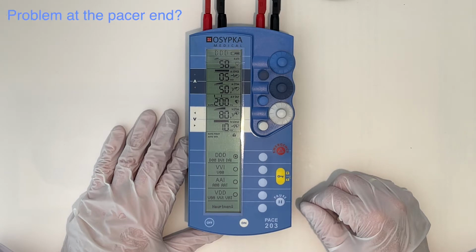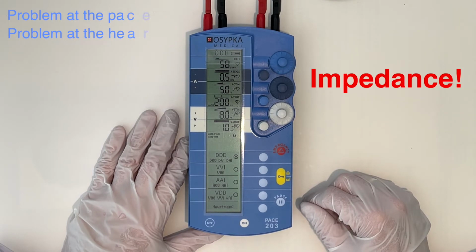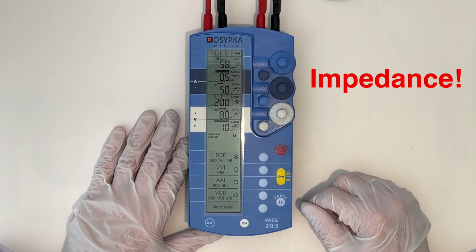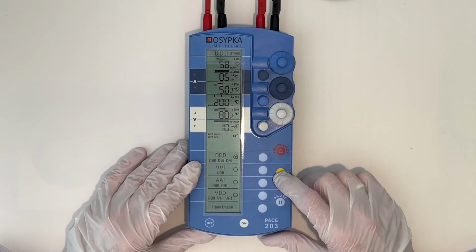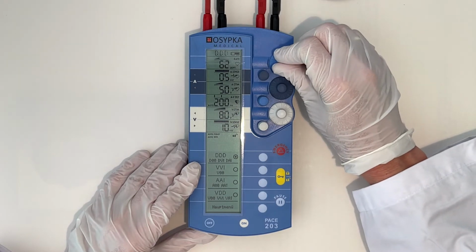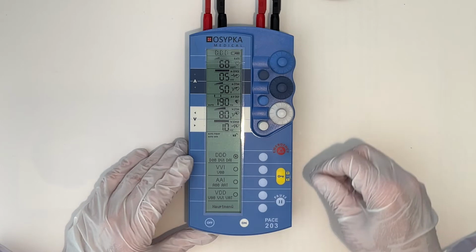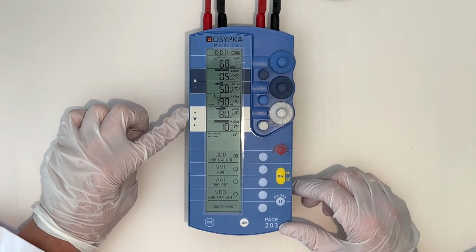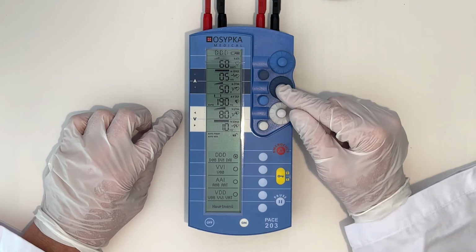Does the problem lie at the pacer end when the cables are connected, or does it lie at the end of the heart where the wires are anchored into the heart tissue? The impedance can help make a decision as to where the problem lies. First, you set the stimulation rate a little higher than the heart rate so that the pacemaker stimulates. To measure the impedance, you only have to turn on one of the controls for the stimulation amplitudes.